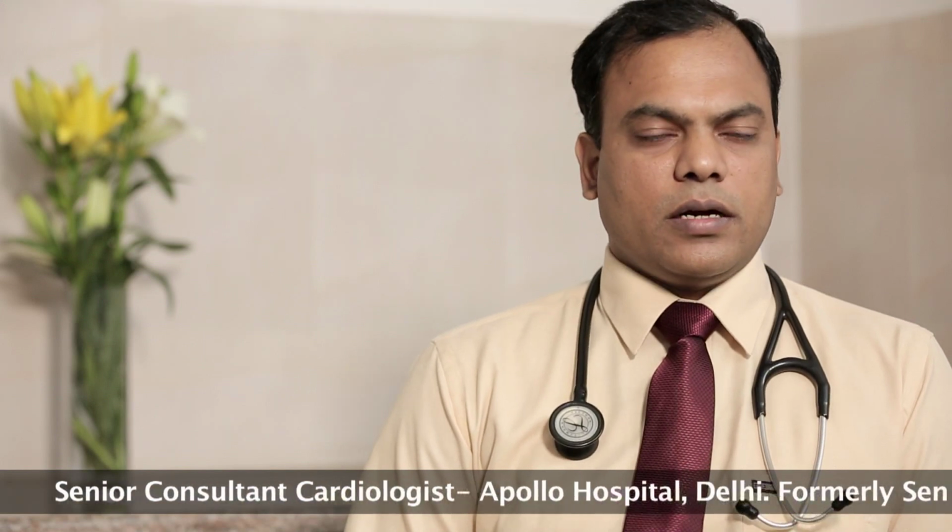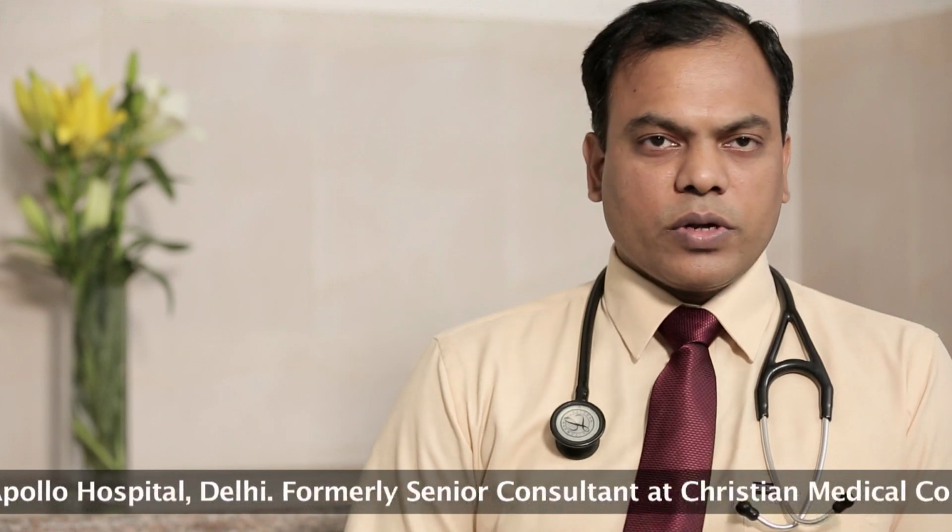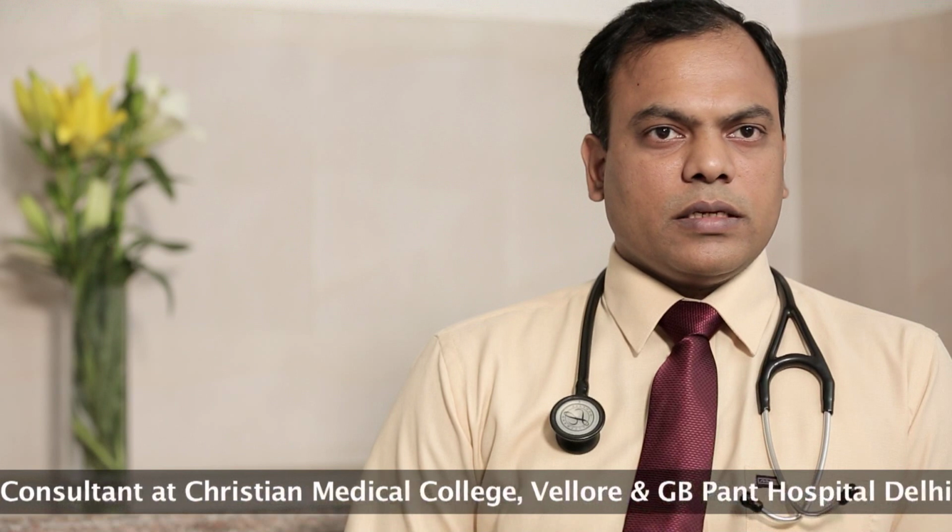Part of the patient education series, I'm going to talk about the stress test that we do for blockages in the heart. Now, when we do a resting ECG, it is a screening test, but we are not able to find out if there are any minor blockages in the heart. Only if there has been a previous heart attack or if there is an ongoing heart attack, that will be seen by an ECG. So to see the blockages in the arteries of the heart which are not of very high grade, that is blockages which are not 100%, for them we have something known as a stress test.